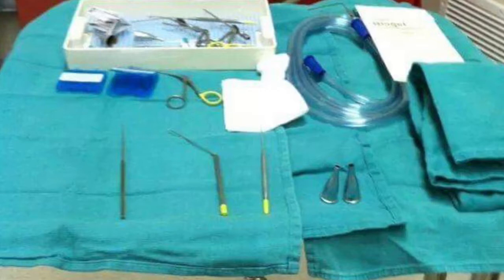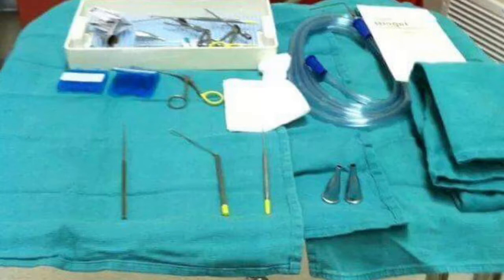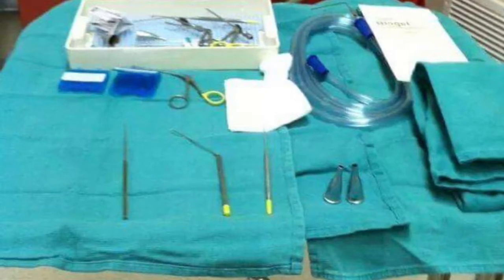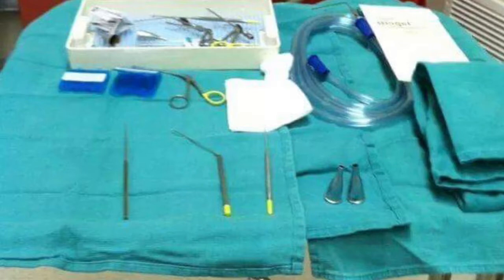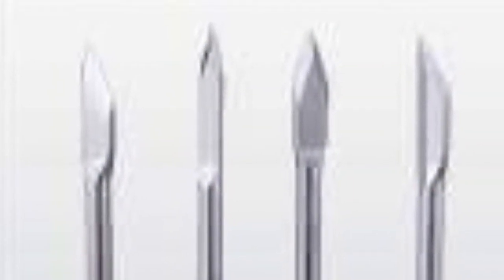Draping is also usually omitted, but if it is used, 3 folded towels are placed around the ear and a U or split sheet is applied. Sterile handles are available for the microscope if used. Incision is made into the tympanic membrane with a myringotomy knife.